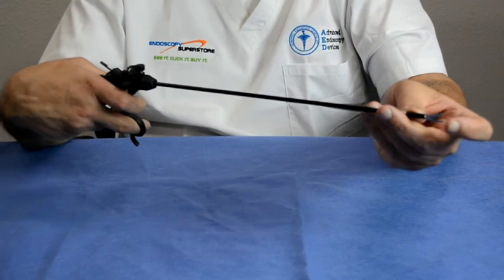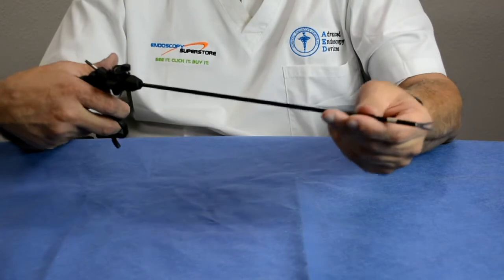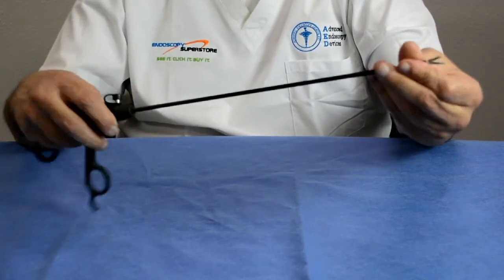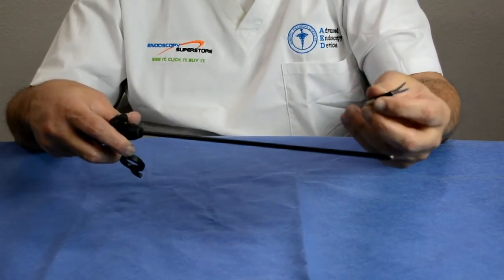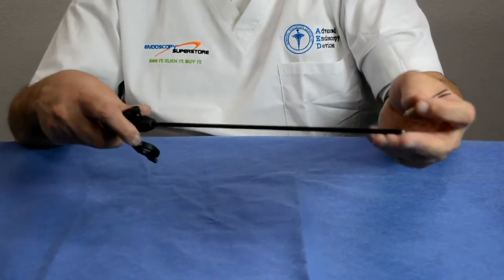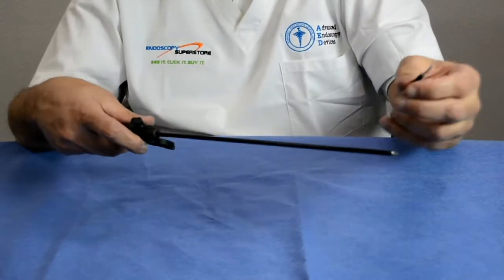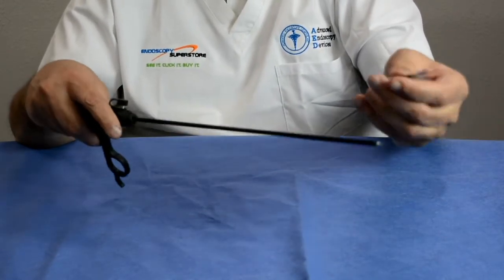Some instruments would get dull, and there was no way to get them sharpened. During a procedure, a dull scissor would take much longer to complete the task. So a new instrument was developed where the doctor could replace just the tips. These tips were more economical than buying a whole new forcep or using a disposable. Some were single-use tips, while others were multi-use and could be sterilized a few times before being discarded.